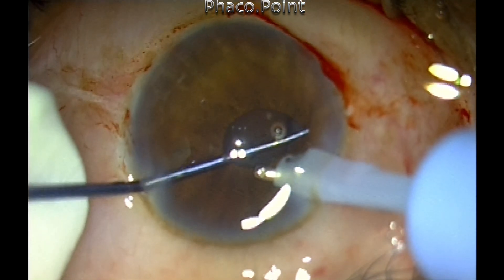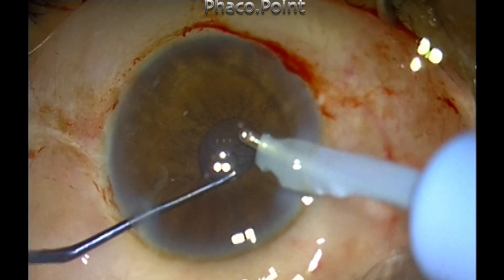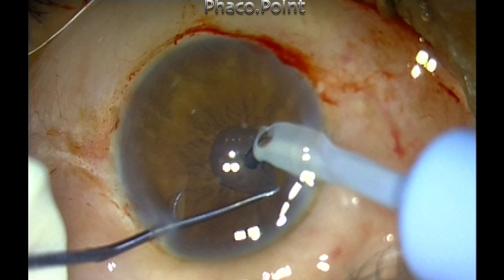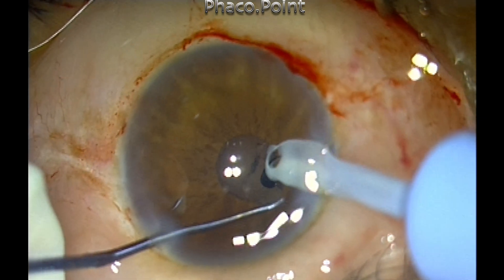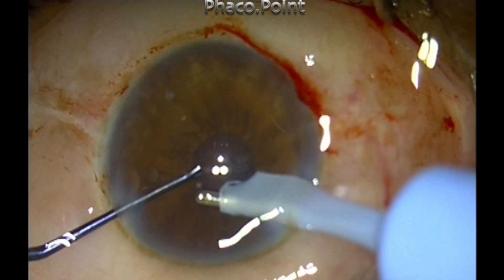In a systematic fashion I retract, visualize, and am able to remove all the cortex from even underneath the sub-incisional area. Once I've cleaned up the capsular bag satisfactorily, it is time to implant the intraocular lens.